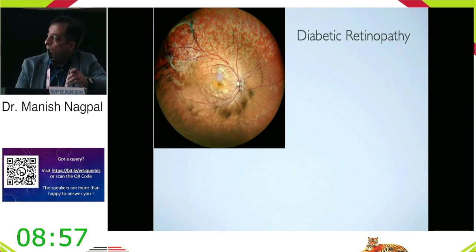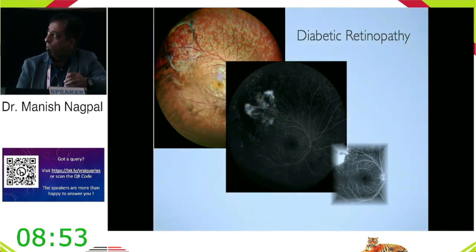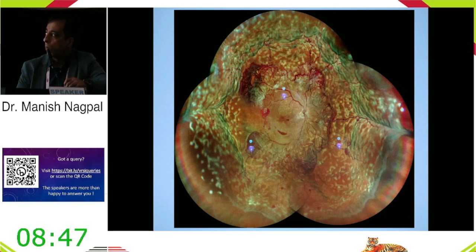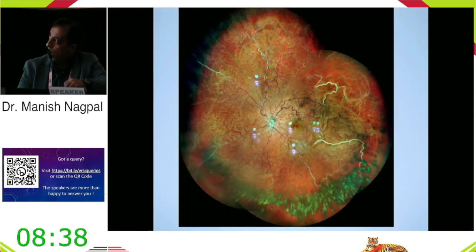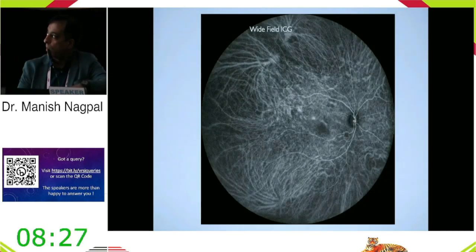And of course, wide field imaging allows you to see as peripheral as possible, to look at new vessels and leaks in the periphery so that you can treat these patients effectively in a sectoral manner. This is a patient who came to us with an extensively done PRP with choroidals, and this is how the FA looks in that patient. Again, a patient with peripheral ischemia, you can see sclerosed vessels, and the wide field images give you the full extent of how well the CNP areas are noted in these.